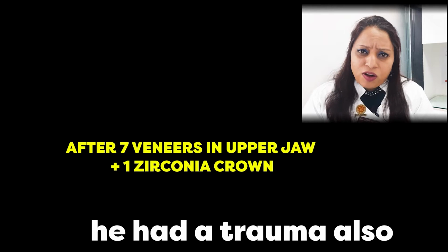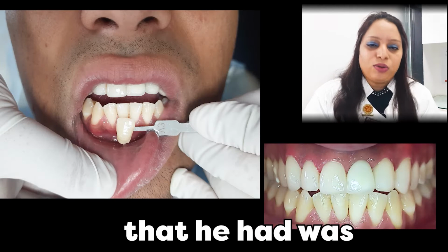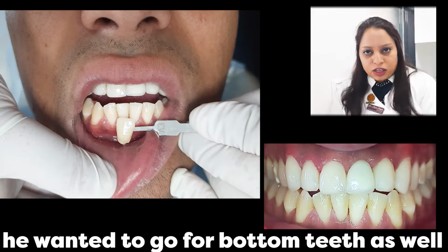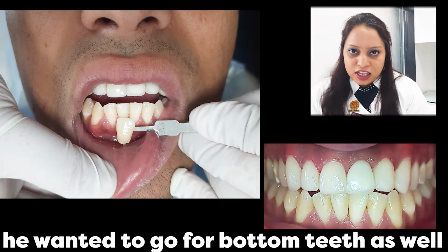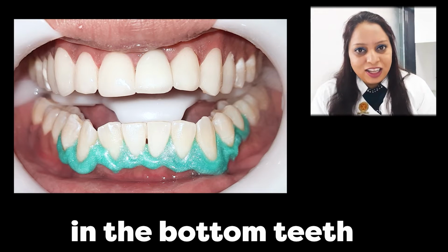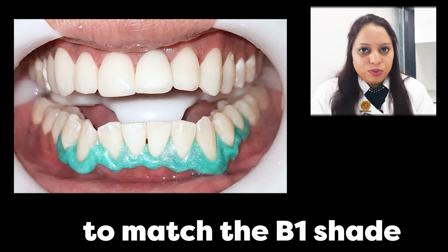He had a trauma also, and the zirconia crown that he had was unaesthetic, and he wanted to change it. He wanted to go for the bottom teeth as well, but he had a crucial meeting. So for now, we did some whitening in the bottom teeth to match the B1 shade.